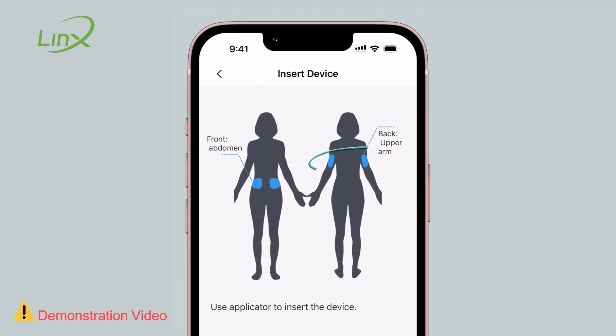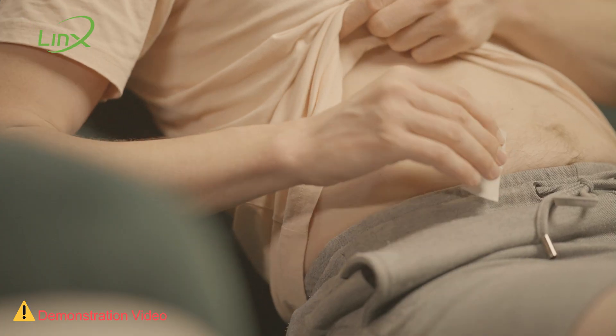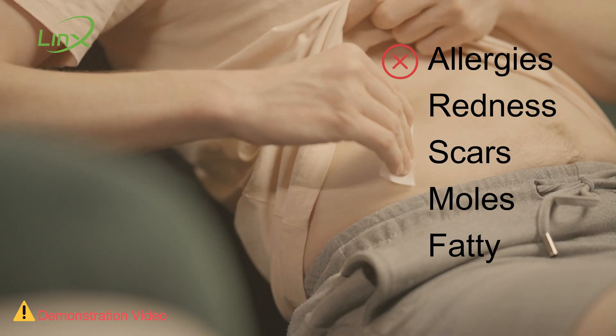Optimal sensor installation locations include the back of the upper arm or the abdomen on either side of the navel. Ensure the installation area is free from any skin issues such as allergies, redness, scars, moles, or similar concerns, and it should ideally be somewhat fatty.